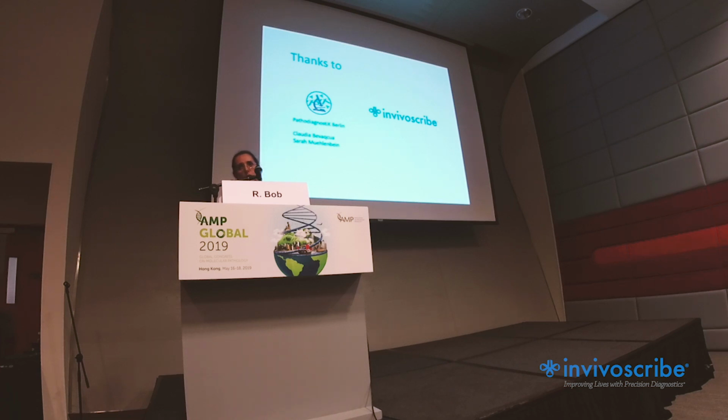Yeah, actually, my question is: do you do the actual ACGT kind of analysis? We have the sequences. We keep the sequences because we can also do minimal residual disease assessment. So we do care about the sequence and not just the peak that you see that is clonal. So it's very important, of course. Yes, we do consider the actual sequence that you obtain. Okay, thank you.